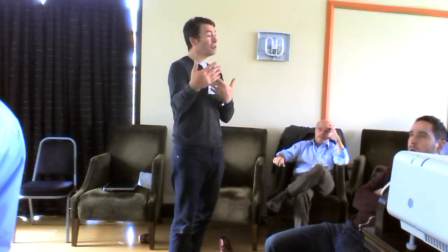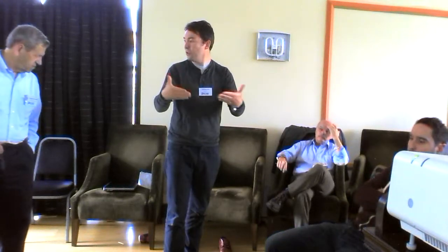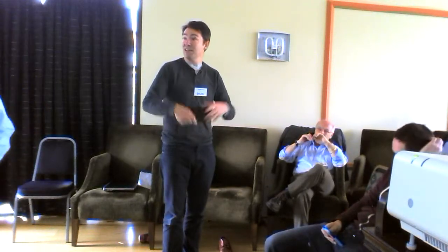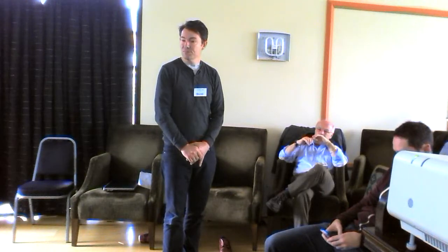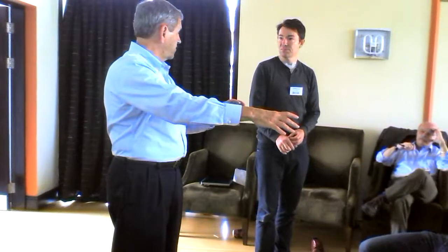And if you don't want to go too deep, you can get quite high resolution. Very high. And if you want to go very shallow, you can have a confocal optical and acoustic system and get photoacoustic microscopy. But I regard that as really a different technique. Yes, it is. To me, that's optics. So this will come out when we do contrast agents. From my acoustics point of view, photoacoustics is an add-on to an ultrasound system that allows you to do some molecular stuff in vivo.